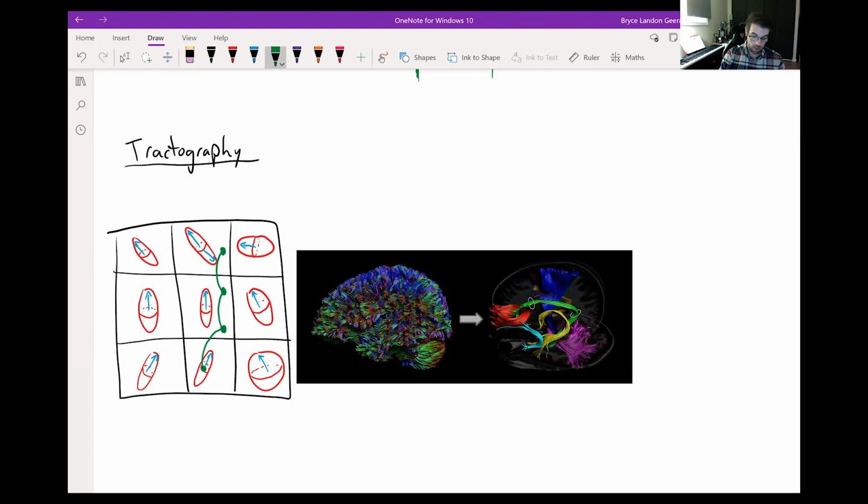And now here we're in a voxel where the diffusion tensor is oriented more up and left on the screen. So we're going to step up and left and then do the same thing and wander out of this voxel to the next one. In this scenario, I'm drawing the step sizes such that they are smaller than our voxel size. That's why we see 2 steps in the same voxel. That's better practice because then you don't skip any tensors that you might be missing.